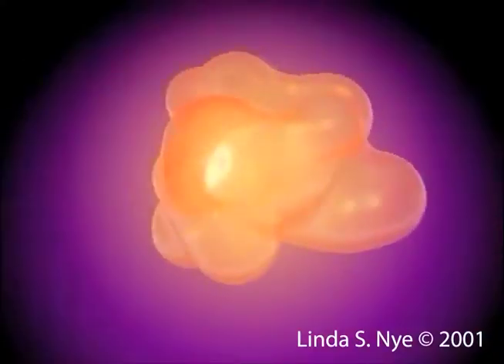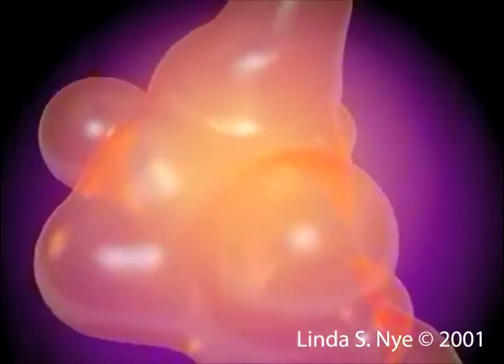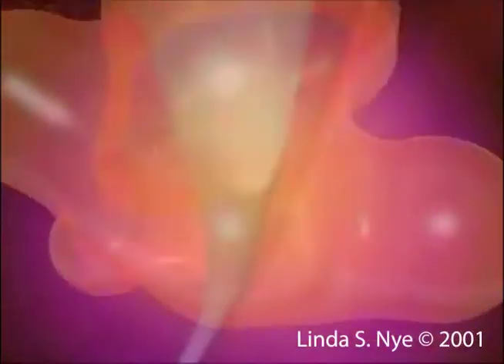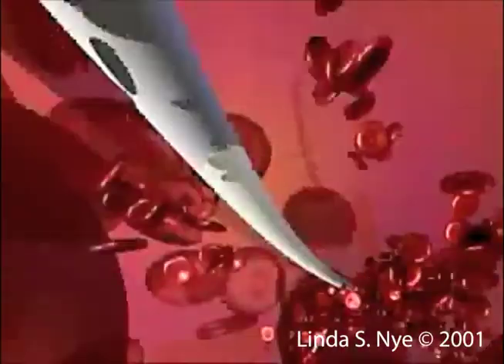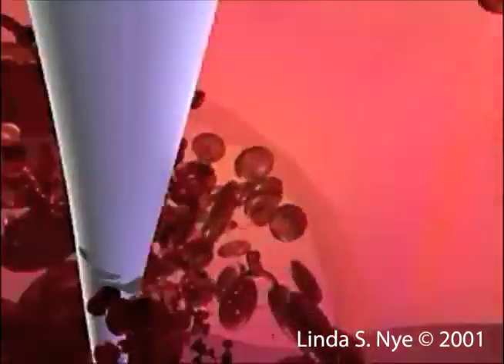Our liquid embolization process using NeuroKryl A redirects blood flow dynamics, reconfiguring the blood vessel lumen, which eliminates the debilitating pressure on the aneurysm.